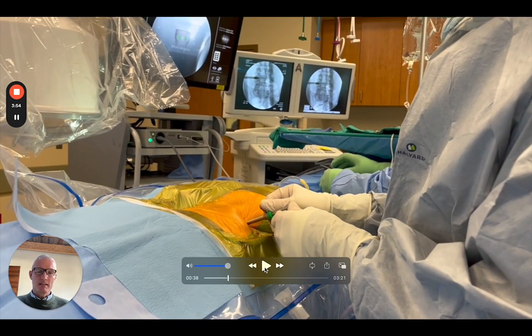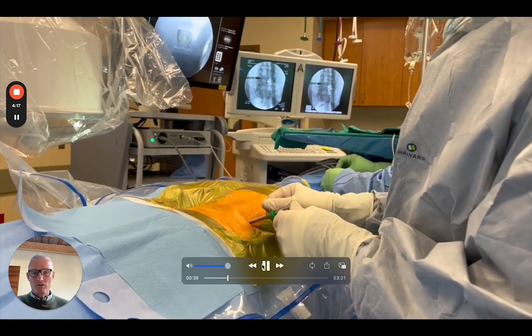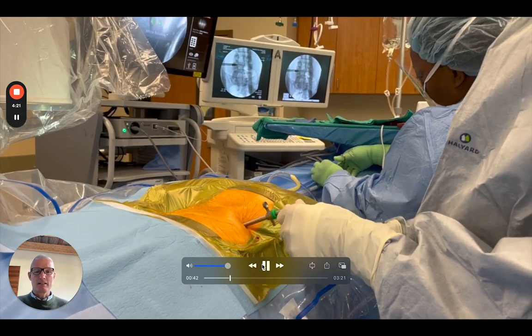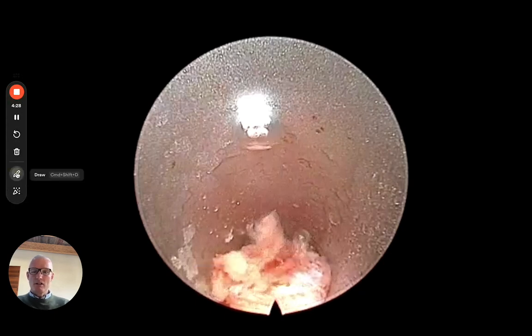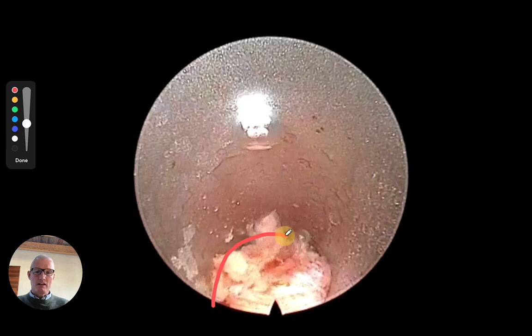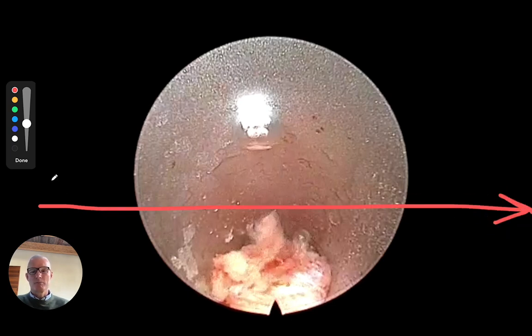Once that's in place, the next step is to insert the cannula. I like to use this corkscrew technique where I start with the open aspect of the cannula facing up into the midline, insert that until the near edge of the opening stops on the facet complex, and then corkscrew the cannula one final time in order to get it to dock on top of the disc herniation. The orientation here is that the cannula opening is facing down; however, the scope is looking up, so this is a relatively constricted view. But this establishes an artificial horizon where the long axis of the dura is oriented appropriately, so we're not going to lose visual cues.